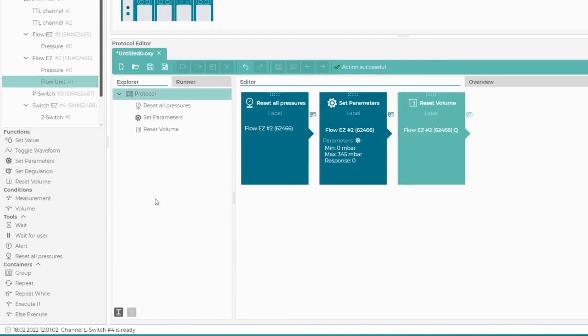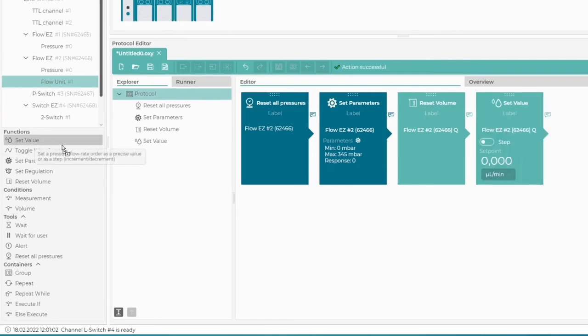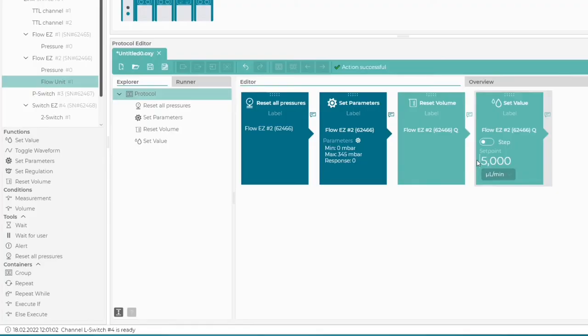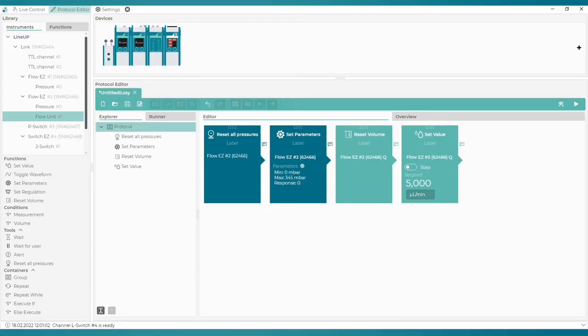Now we reset the volume counter. The preparatory part of the protocol is done. We can now set the flow rate to control the FlowEasy pressure through the flow unit.